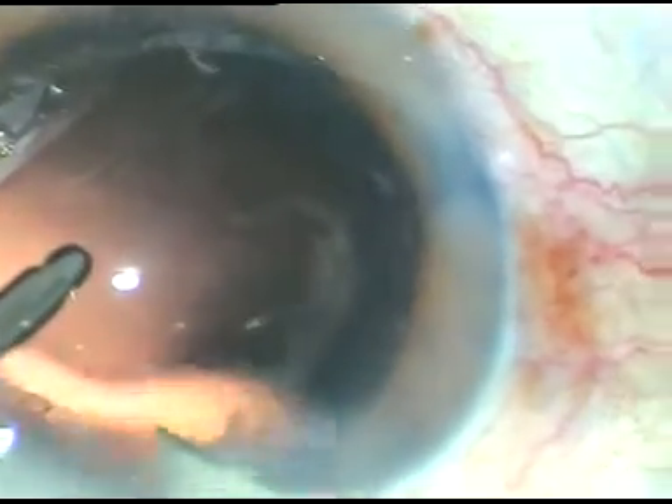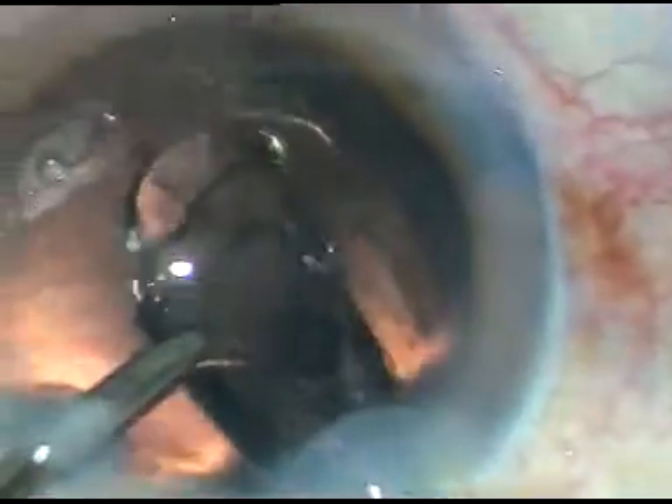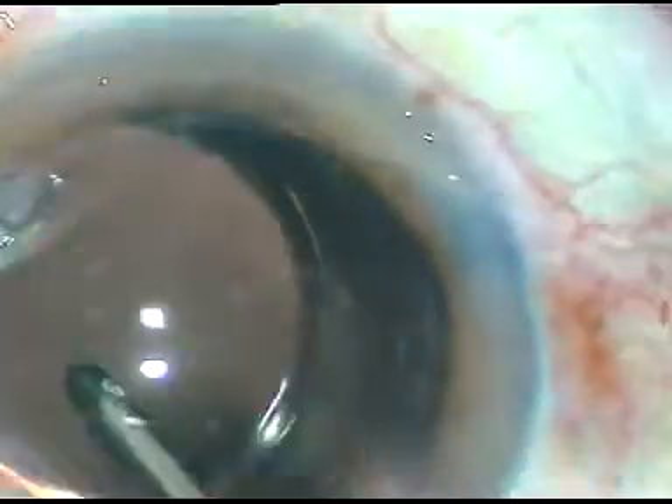In this case, I am going to enlarge the main incision by 0.2 millimeter for easy implantation of the intraocular lens. The lens is now in the bag.